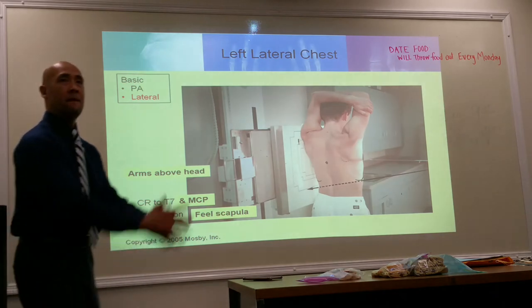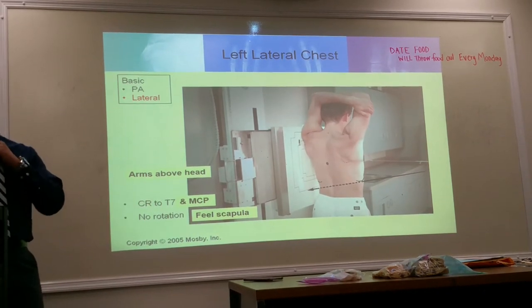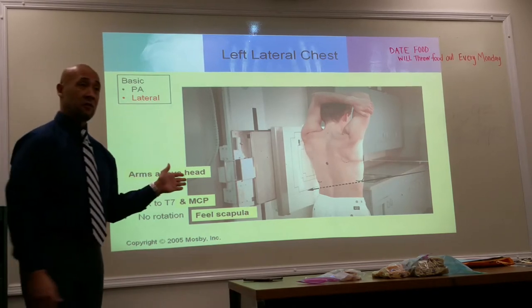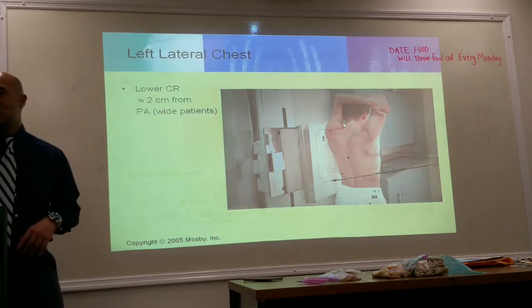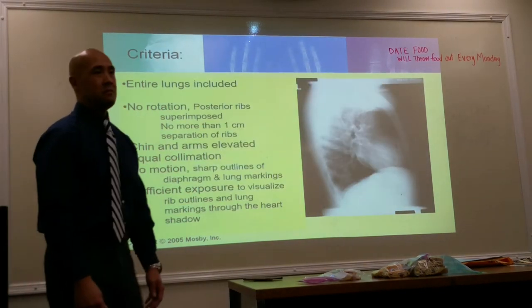Questions? Yes. So after your hand is perpendicular, then you rotate the end. Right. So I'm going to get him perpendicular first, and then from there I will rotate him slightly. And I mean slight. Because if you don't, you can end up with two posterior ribs instead of one. Okay.